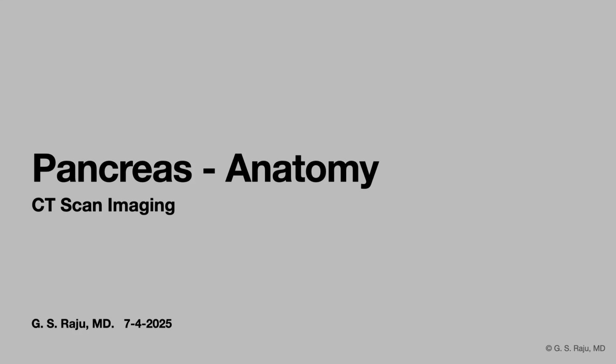Greetings. Let us learn about pancreas anatomy, what the radiologists look at, and what we should also be looking at.